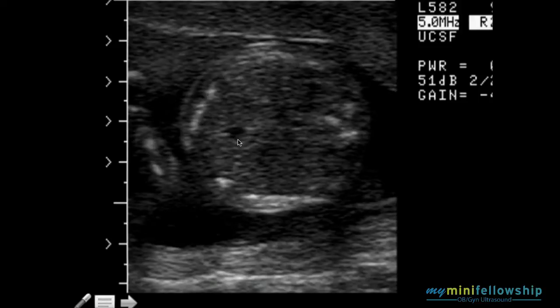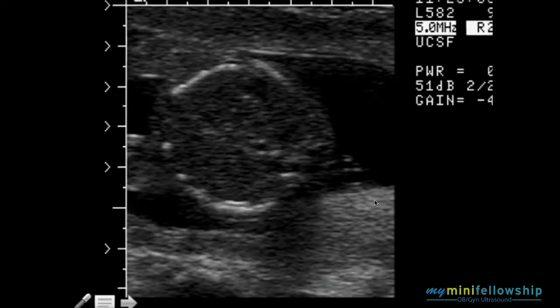And there's three fluid-filled structures that are commonly seen in the abdomen: stomach, umbilical segment of the left portal vein, and the gallbladder. This, in the dead center of the fetus, almost certainly is the umbilical segment of the left portal vein. So we know that this tissue has to be liver, and therefore this is something between the abdominal wall and the surface of the liver. Now we go back here.